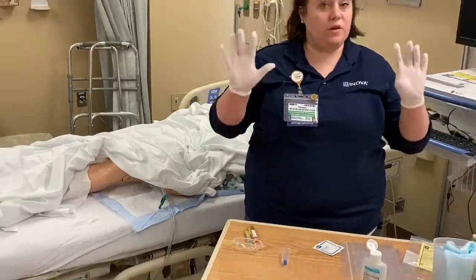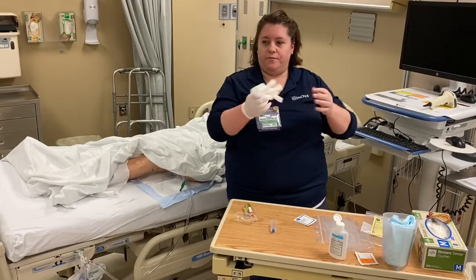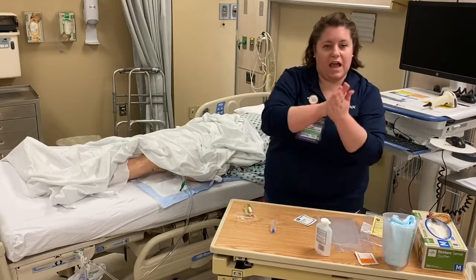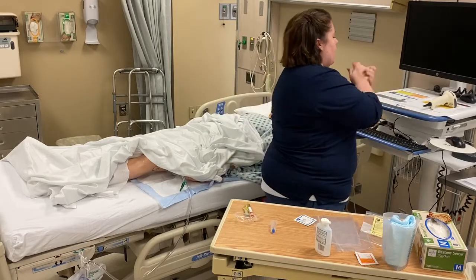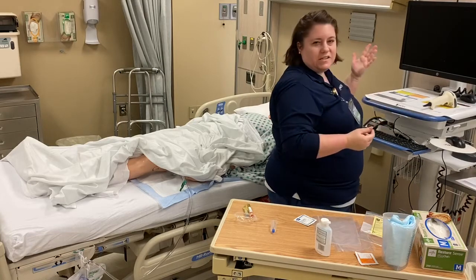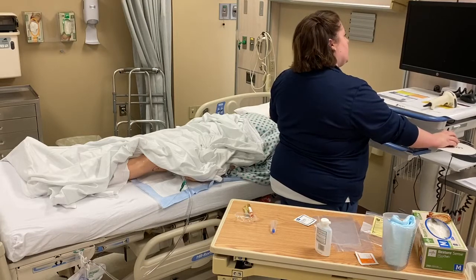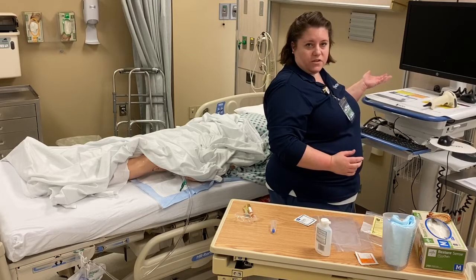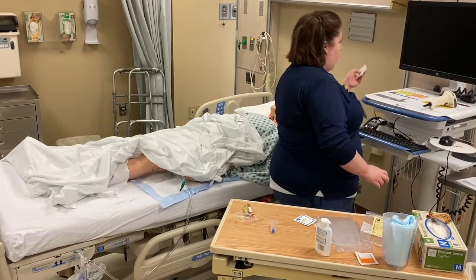When I go to my computer, I want to take my gloves off because I don't want to contaminate my computer with my dirty gloves. All right, so I'll do my hand hygiene, and I'm going to come back over here to the computer. So on my screen, it lists all of the tests that my patient has ordered. So I see some blood tests in there and some other things. So what I want to do is uncheck any tests that I don't want and make sure that only the tests that I do want are selected on my screen. Once I do that, I'm going to click the print and my labels will come out.